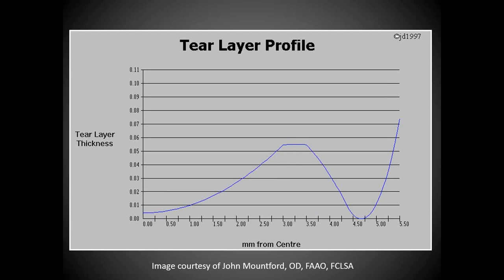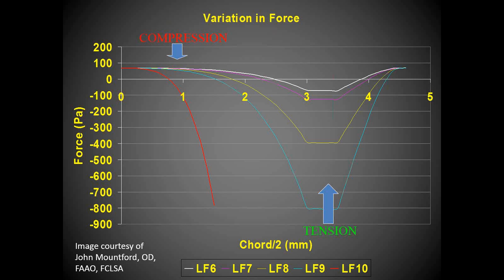Ortho-K lenses do not work by mechanically compressing epithelial cells. They work by hydraulically creating little tiny forces between lens and cornea, and that's what produces orthokeratology treatment. If your lens lands on the corneal apex, it would produce staining, and any ortho-K lens that's producing staining needs to be adjusted.